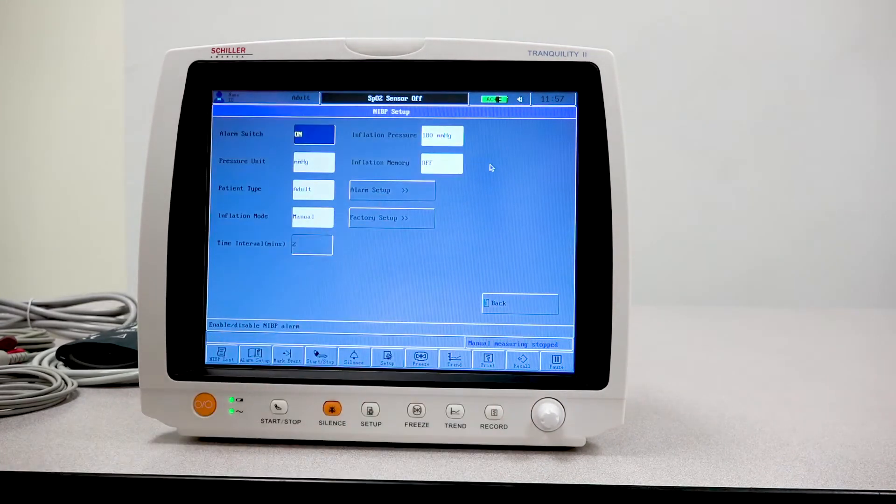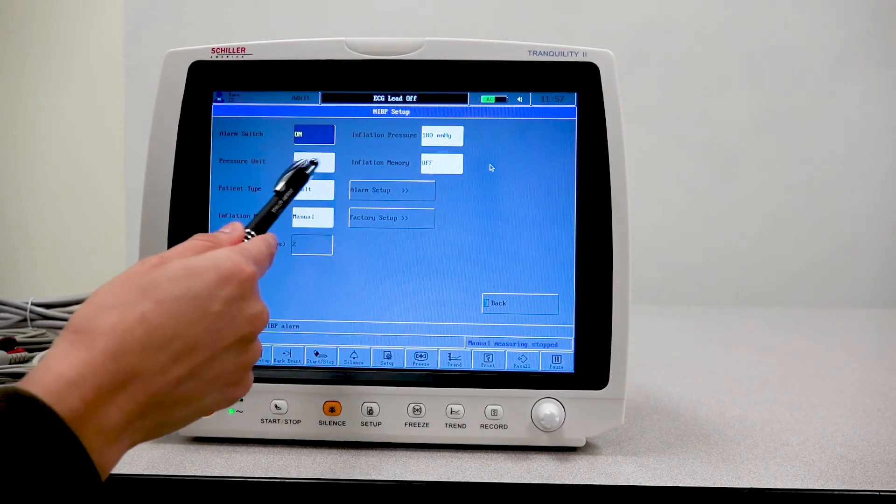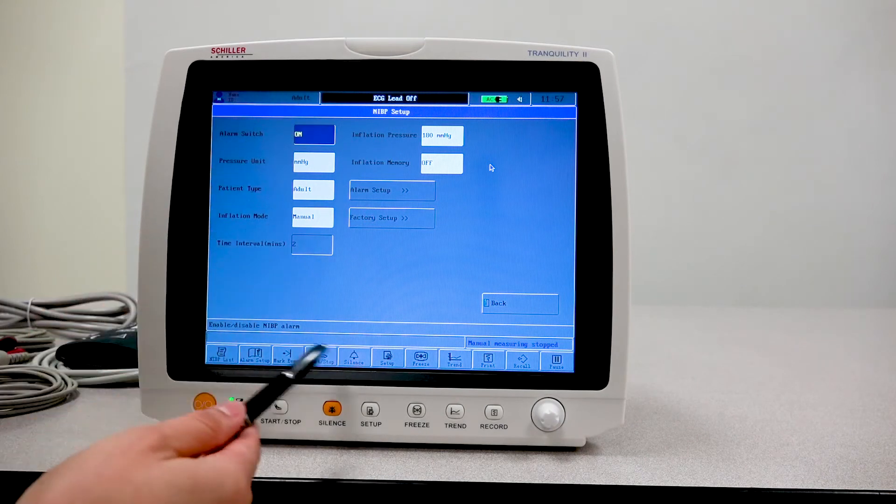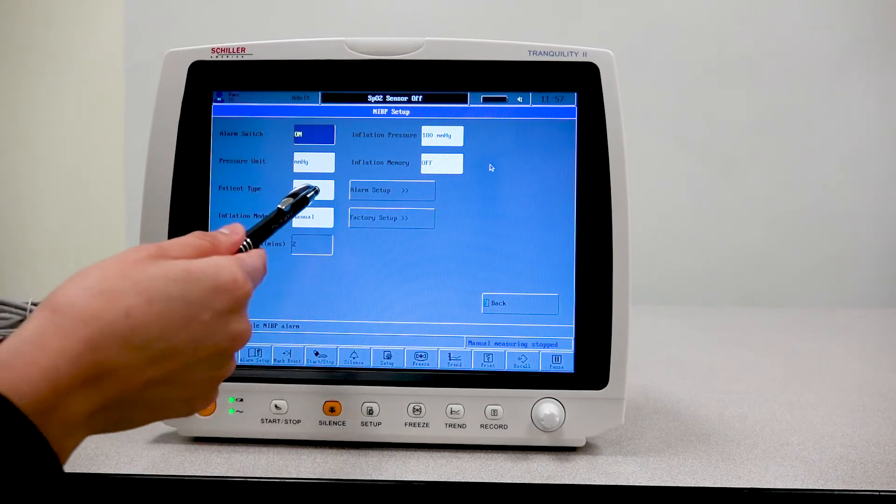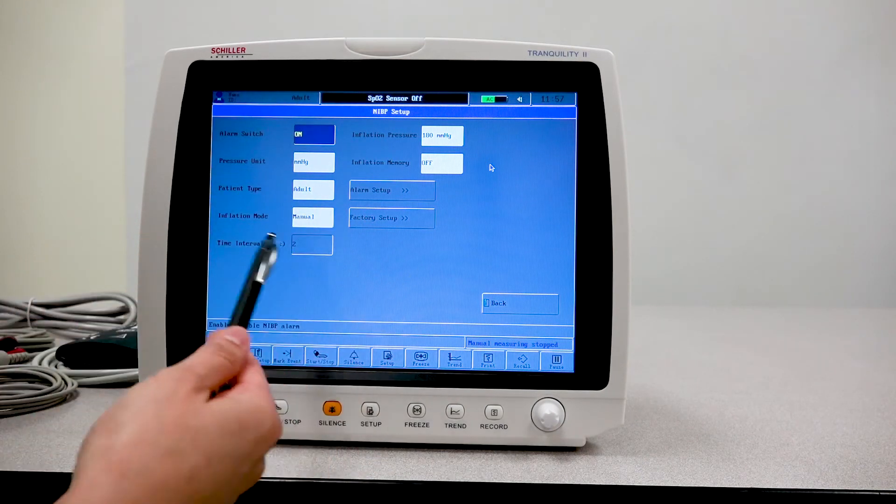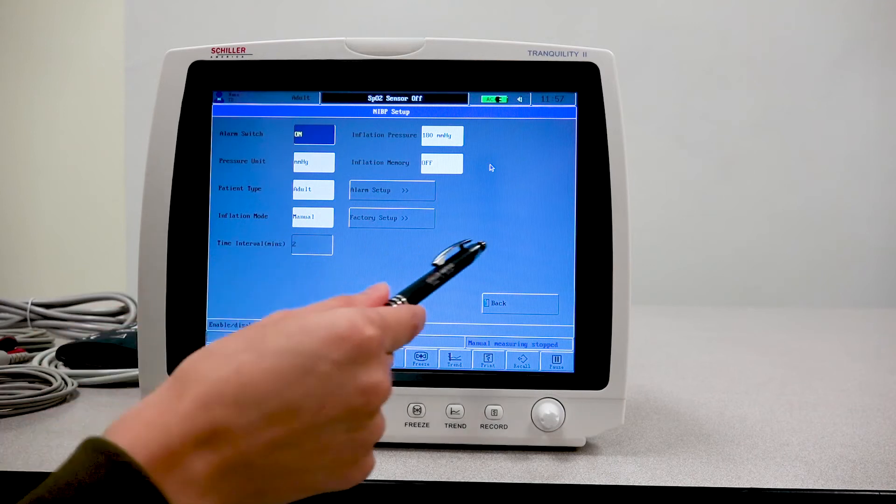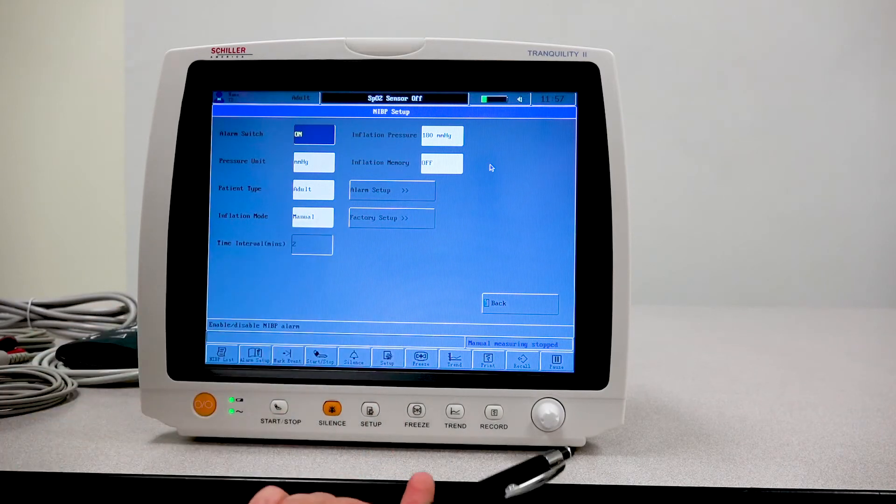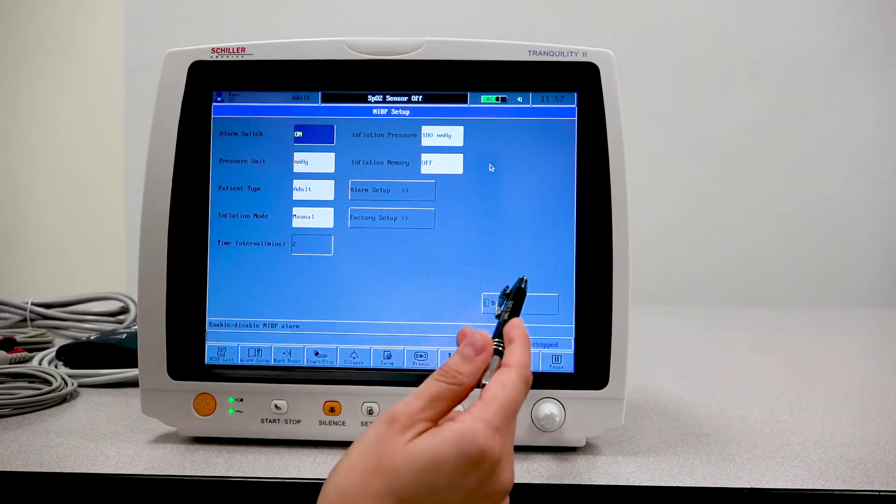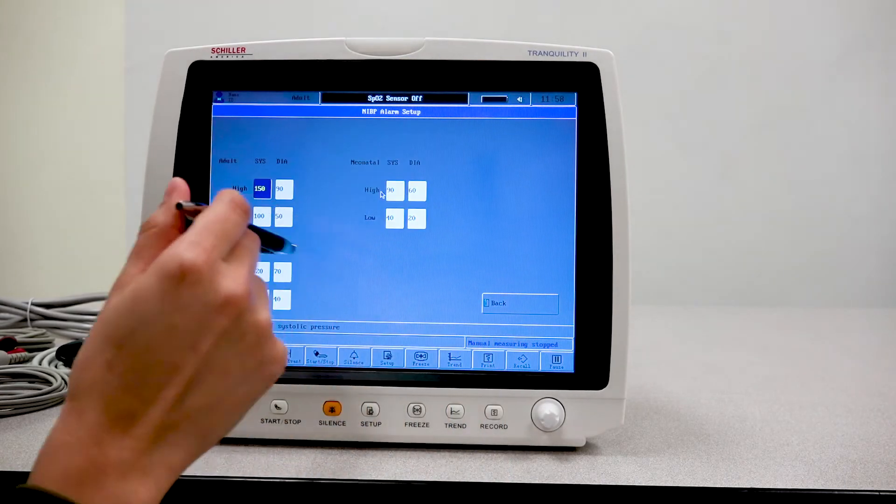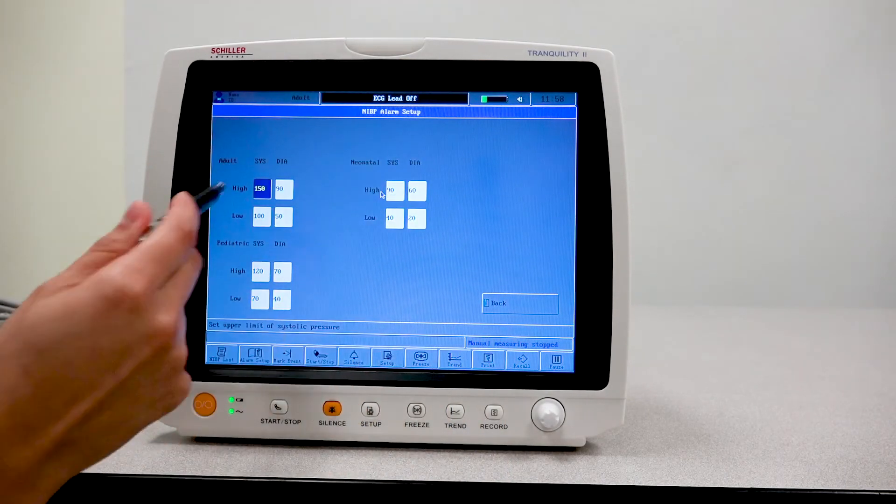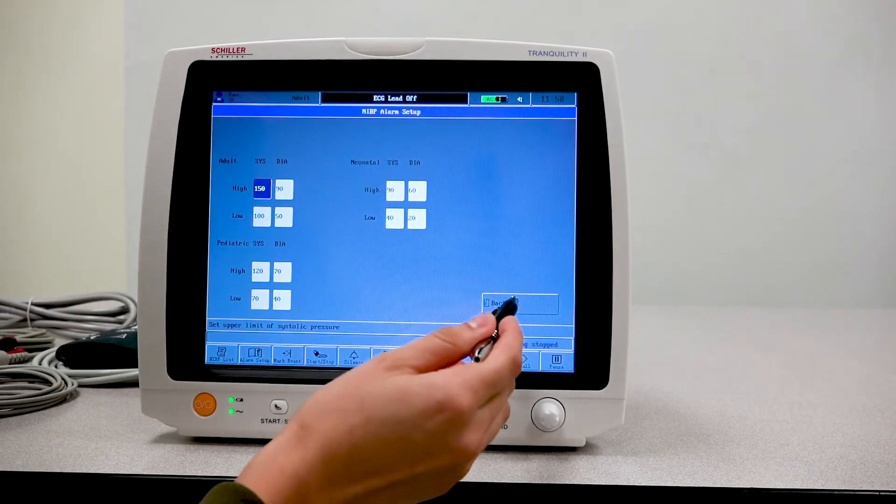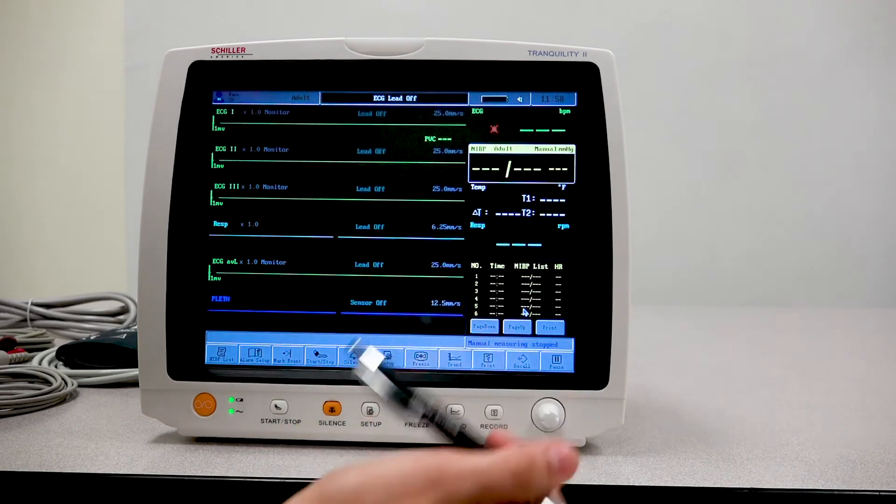Let's do NIBP. You can select the units that is used to measure, the type of patient, whether it's adult, a child or neonate, and whether or not you want the inflation to be manual or automatic. You are able here to set the alarm limits.